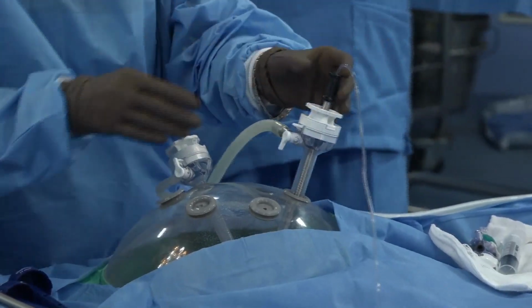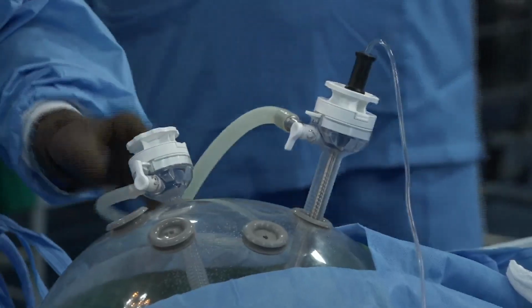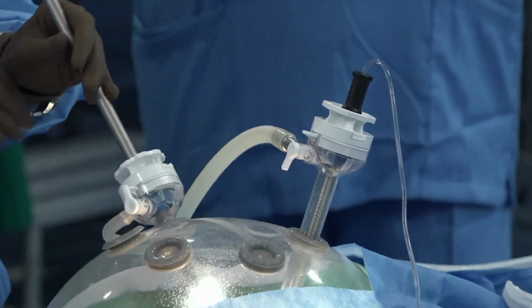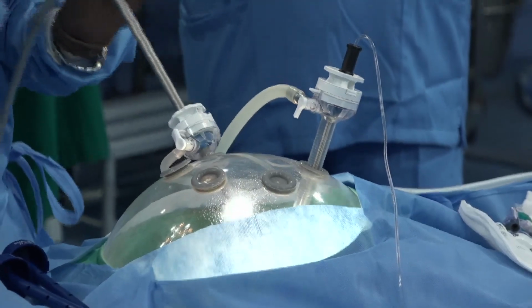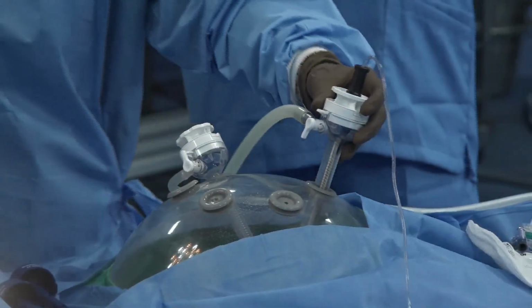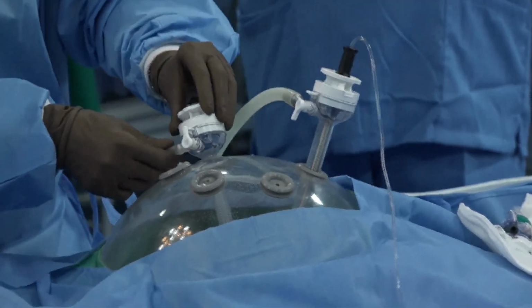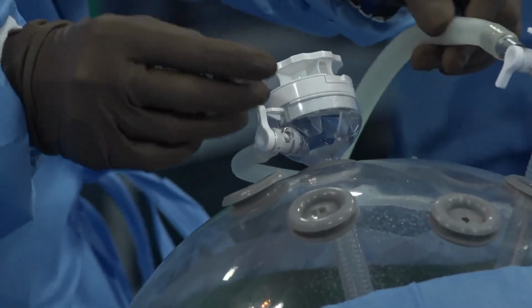Just move it out. So as you can see, once you have prepped your patient, the camera port is here. Your telescope is inside the abdomen, which is held in a Book-Walter retractor system. If you have robotic ports, that's fine. If you don't have, you can just use the retractor system that you have. It is very important that these are not moving during the whole procedure. They have to be very static. And then you make sure that all the airlock systems are working fine. This is the CO2 insufflation. I beg your pardon, this is the exhaust, the outlet, and this is the CO2 insufflation.